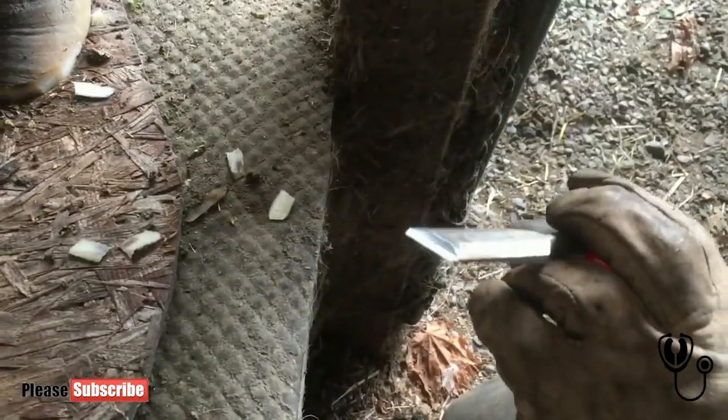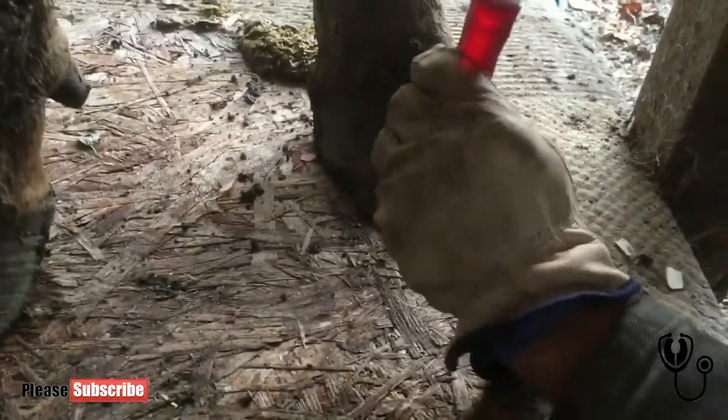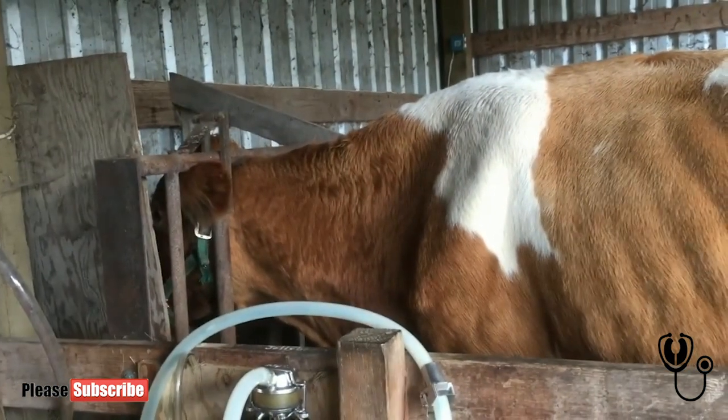The beveled end goes toward the cow — so the beveled end, if it goes towards the cow, it splits it away from the cow. Good girl, Jelly. You see her jump every time. Good girl.